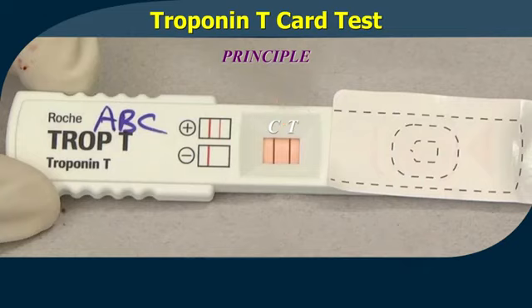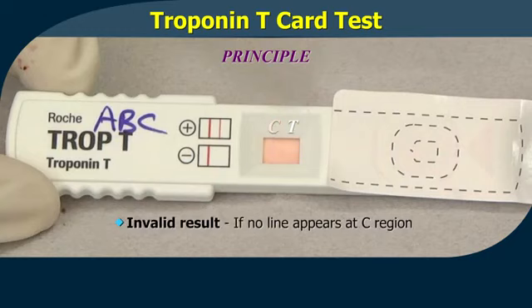If the concentration of this marker in the sample is above the cutoff level, red bands appear at the corresponding test lines and the control line. If the concentration of the marker in the sample is lower than the cutoff level, only the colored control line can be seen in the test window. This colored control band must always appear at the control line position for valid test results. A test result is not valid if the colored control line does not appear in the test window.